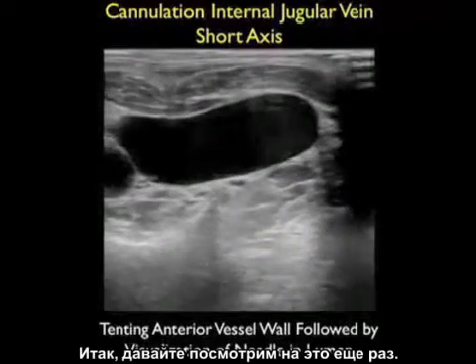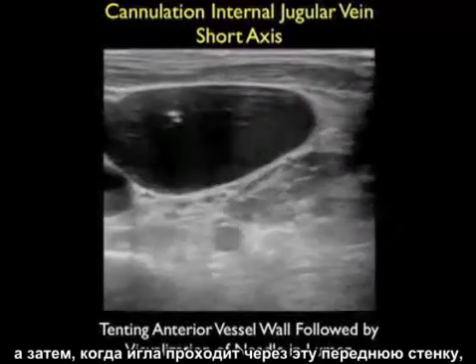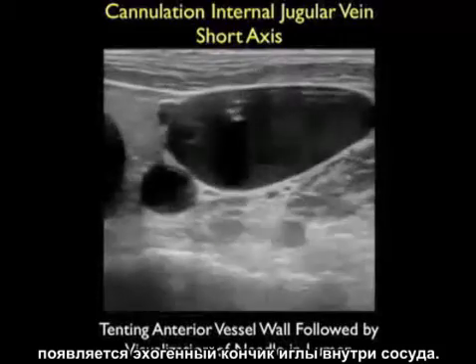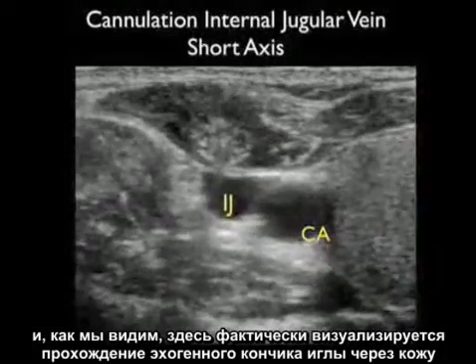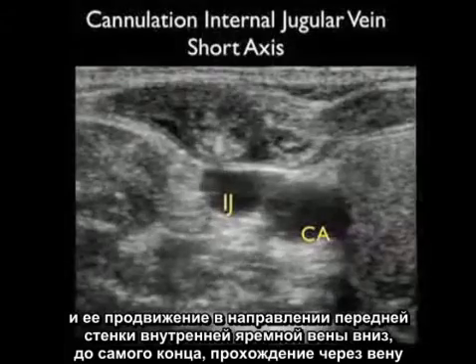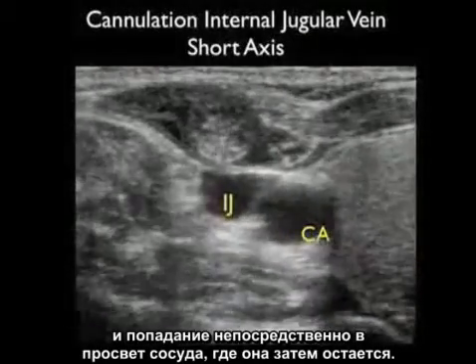Here's an actual cannulation of an internal jugular vein. Notice the deflection of the anterior wall of the vessel as the needle pushes down on that wall, followed by the appearance of the echogenic tip of the needle within the lumen of the vessel. In a different patient receiving a central line, we can actually visualize the echogenic needle coming from the surface and going all the way down through that anterior wall of the internal jugular vein to park directly into the lumen of the vessel.